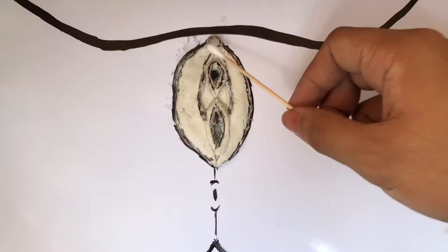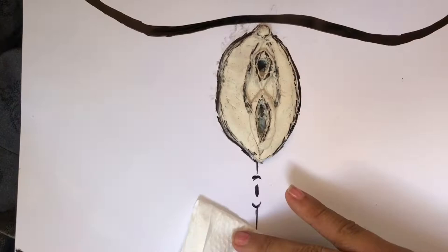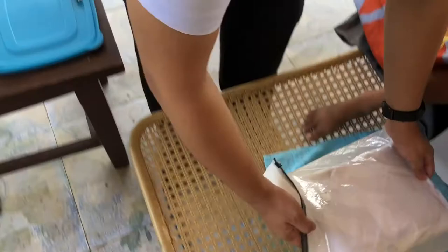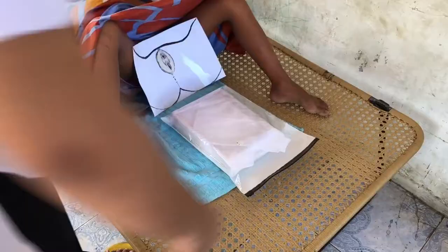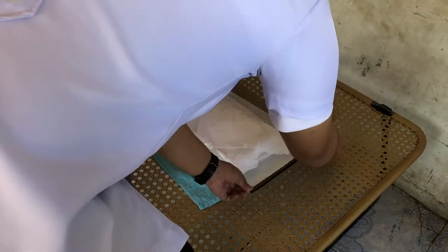Provide perineal care if needed. Place tray between the thighs facing foot of the bed. Adjust drop light — a flashlight may be used. Place waste receptacle at an area near you.